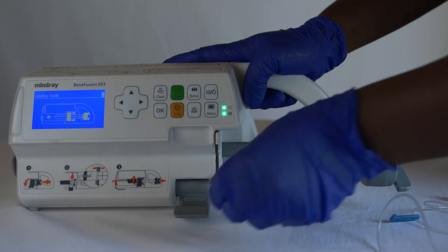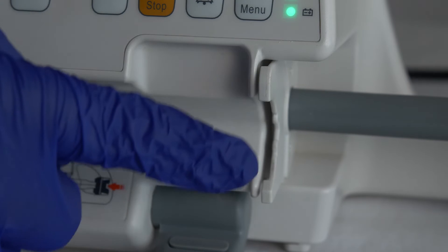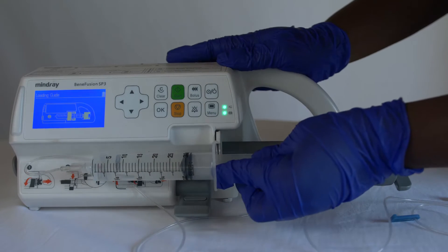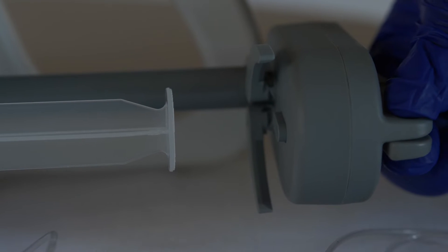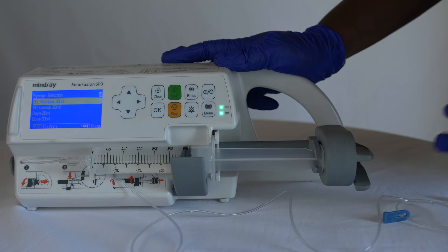Open the syringe clamp. Be careful not to damage the flange slot when inserting the syringe. Place the syringe flange into the flange slot and clamp the syringe. Squeeze the handle to open the clip, align the slider snugly against the syringe plunger, and close the syringe clamp.